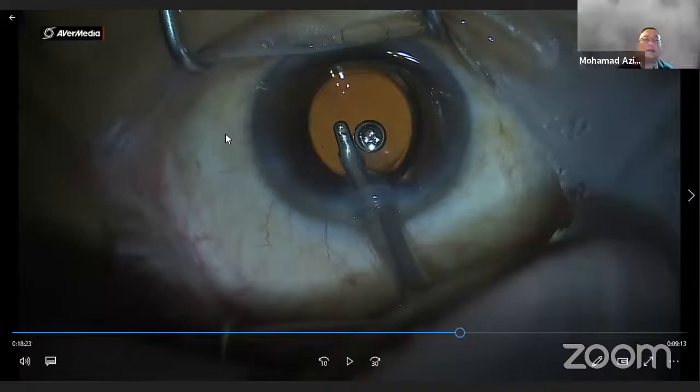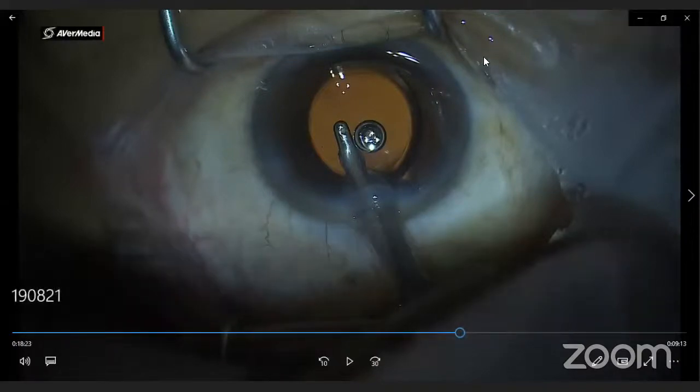Cuba kita cari yang tadi kan pasal duty cycle tu kan. Can we just look at a few videos? Tengok ada tak memang jalan ke tak.